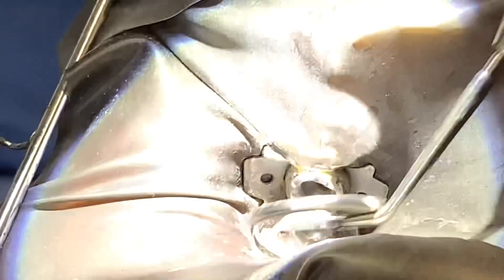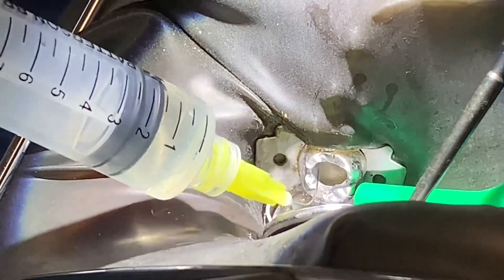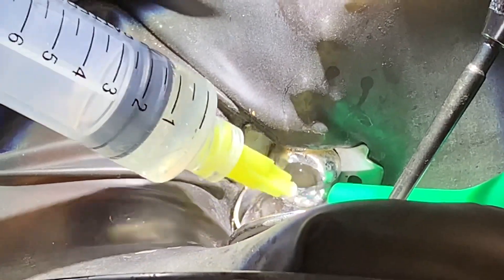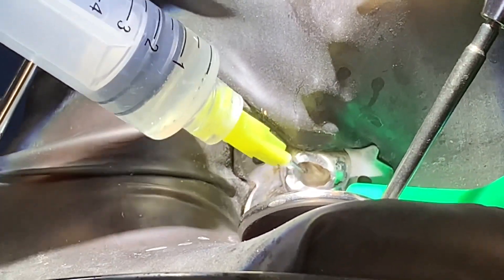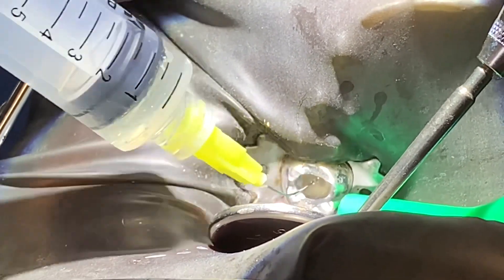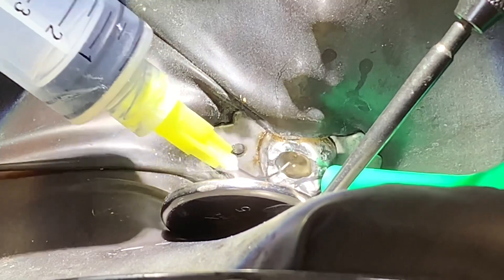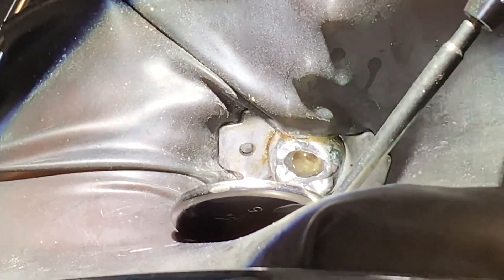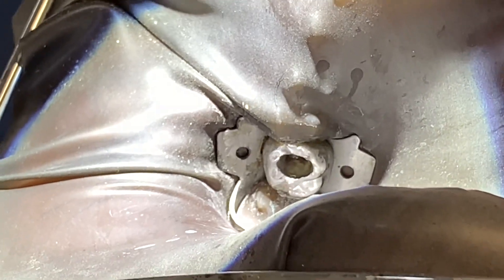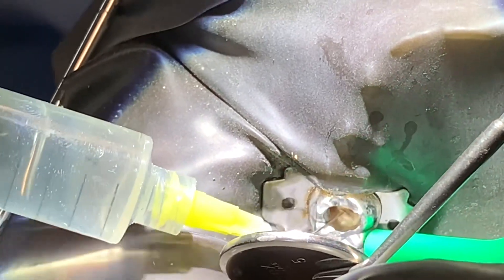We're going to irrigate it again next, and again all kinds of stuff will come out. The solution to pollution is dilution — go in there, go in there. Yeah, that was a big piece that came out.